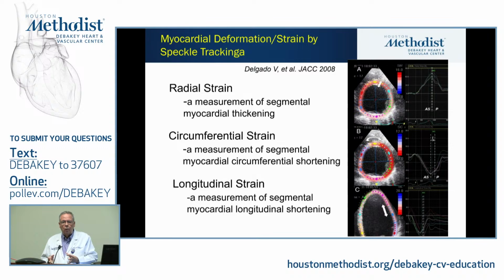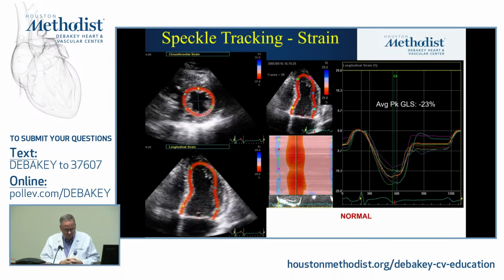There has been a lot more research with findings that are applicable to clinical practice with the longitudinal compared to the circumferential, in part related to the way the fibers in the heart are oriented and contraction occurs. So I'm not going to cover too much of radial and circumferential, simply because they are still looking for a disease to provide data for, whereas longitudinal strain already has a good record of findings that we'll be showing, okay?